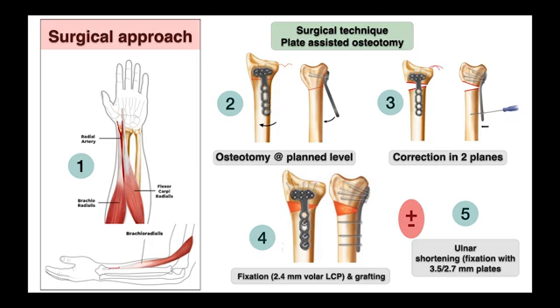We used a volar FCR approach between the radial neurovascular bundle and the FCR tendon. The brachioradialis tendon is tenotomized and a Z-plasty is done. The osteotomy is then performed at a pre-planned level parallel to the articular surface, making sure the osteotomy will end up proximal to the distal segment of the plate.